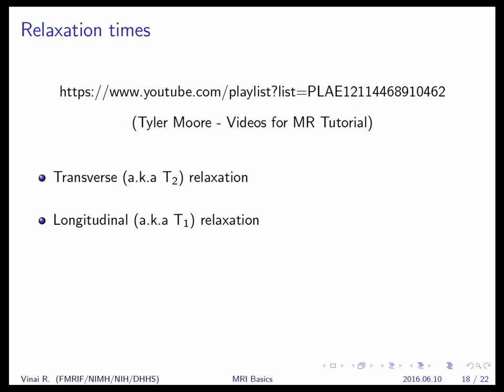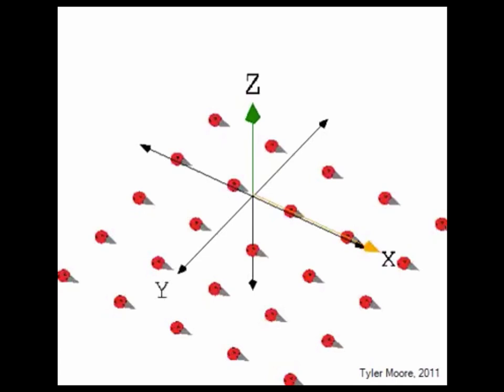So I have a couple more videos here. The first case here is what's called T2 relaxation. So we have a series of protons at some rest equilibrium state, some population that we can give some energy to, and they'll switch states, and then we can detect the signal from them as they try to get back to equilibrium. But the signal never lasts for an infinite amount of time. It actually decays away with a very characteristic rate. And this is getting back now to your question about what's happening in the different tissues or the different tissue compartments.